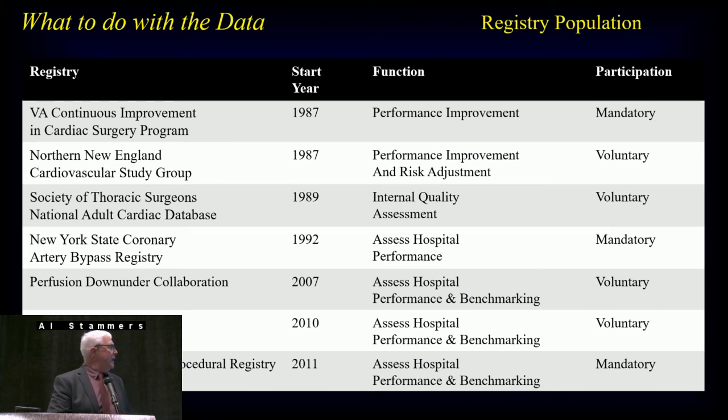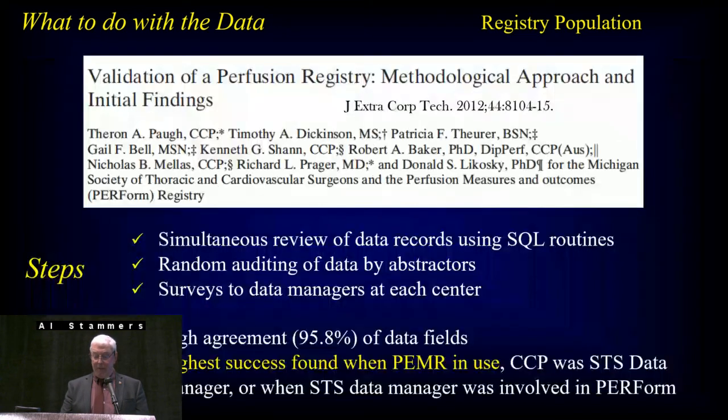And then you've got the Perfusion Down Under collaboration. You have PERForm out of Michigan. And then you've got the registry out of Specialty Care that is now in its 7th year. And then there's whether or not you're mandated to join it or it's voluntary participation.